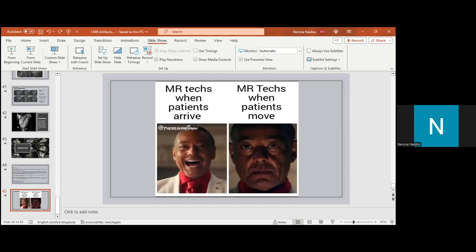So Nerissa, while they're waiting, we do phase contrast for brain imaging, and I did recognize that velocity encoding artifact that you showed, because we see that quite commonly, especially when we're trying to do phase contrast on animals, because we do a lot of animal research here. It's not clear sometimes; we set up arbitrary VENC values. It's like trial and error. So what happens when you have a patient that has arrhythmia or some other cardiomyopathy that makes it very difficult to quickly evaluate on the fly what the right velocity encoding should be?